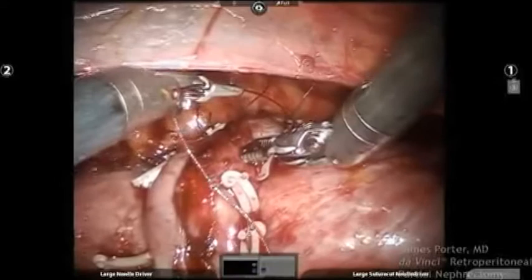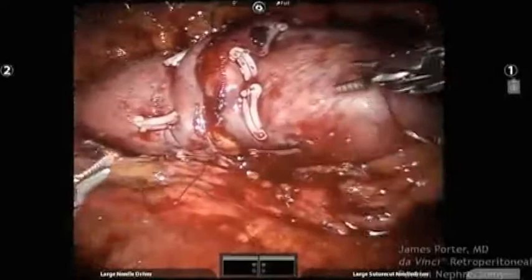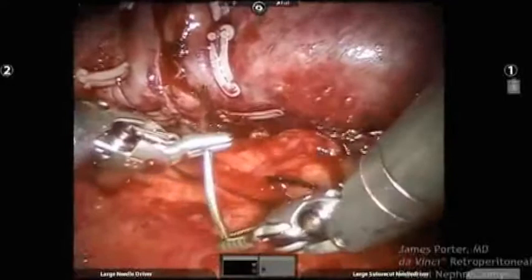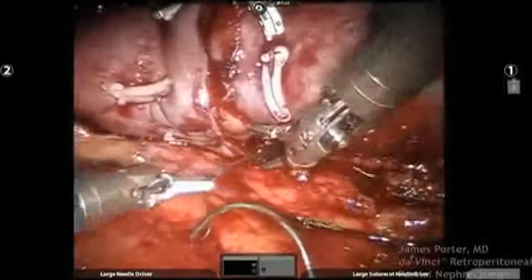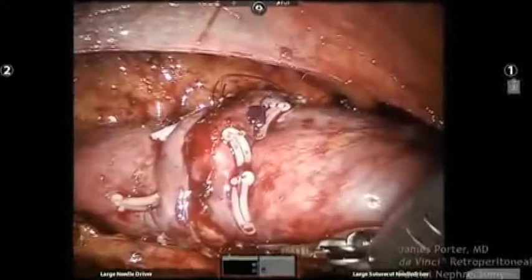Certainly, I think that's a consideration, and it all comes down to surgeon preference. It ranges from someone not clamping to clamping 5 minutes to 2, so your point is well taken. I think that's why Ben asked the question, but ultimately, whether it's 15, 10, 20 or 17 minutes, no one's shown a single bit of difference, short-term or long-term, with anything under 30 minutes. If you can do 2 minutes, that's ideal, but ultimately it's going to be what you're comfortable with, hemorrhage-wise and all that. But yes, I would imagine you could have taken it off. I don't know what your panel thoughts are.